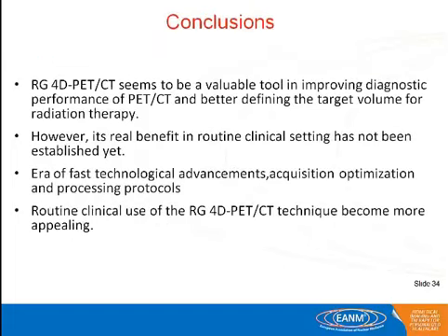treatment session. So as a conclusion, respiratory gating seems to be a valuable tool in improving diagnostic performance of PET-CT and better defining the target volume for radiation therapy. Actually, we do not know if there is really an improvement in patient survival. That's still not known. And so we feel that, with the continual stress on tailoring treatments to patients, the routine clinical use of respiratory gating for PET-CT will be appealing for the years to come.